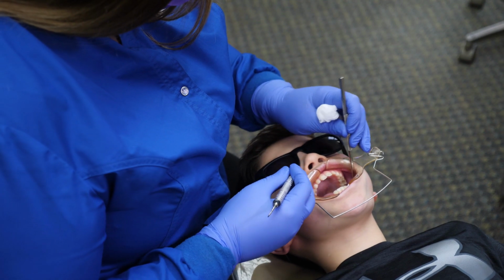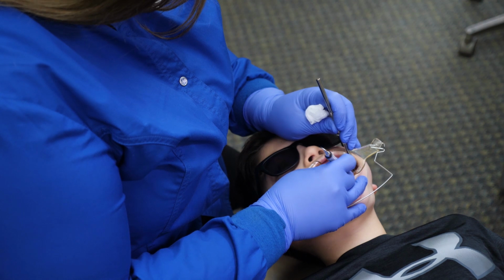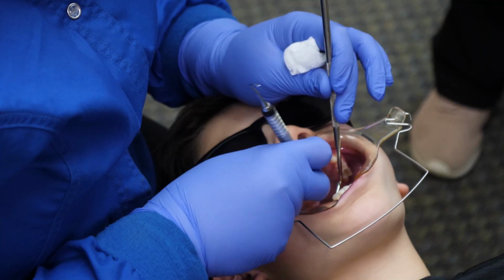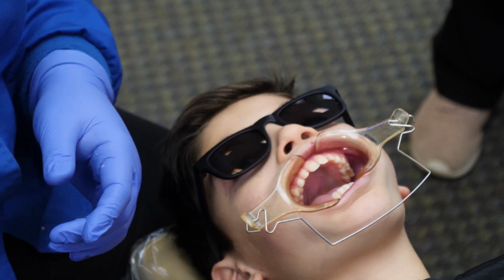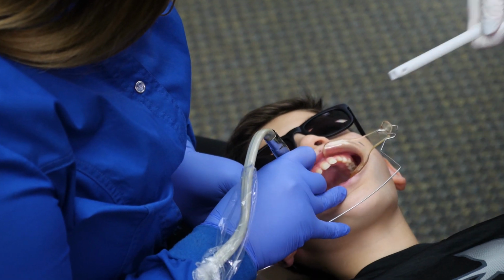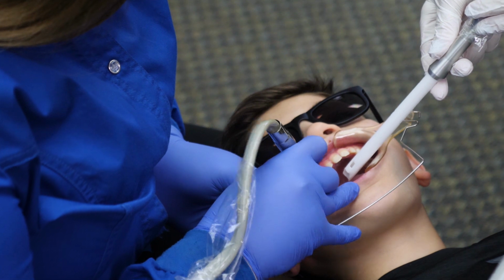Our appointment following removal of the expander is called the CRA. We just abbreviated Clean Remaining Adhesive. This appointment is 6 to 8 weeks after the removal or deband appointment of the DCE. This allows for any inflammation or any gingivitis to clear up. So cleaning the remaining adhesive is comfortable for the patient.